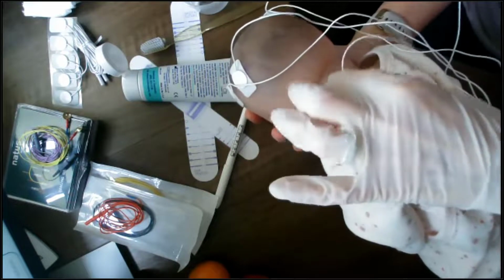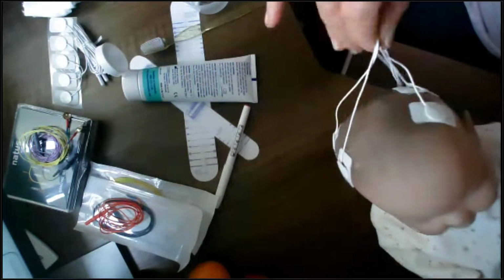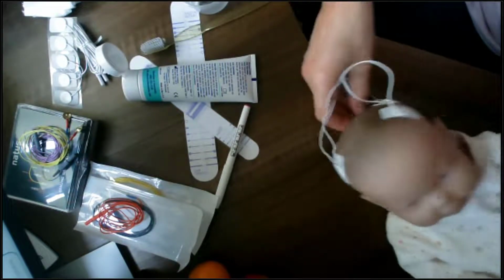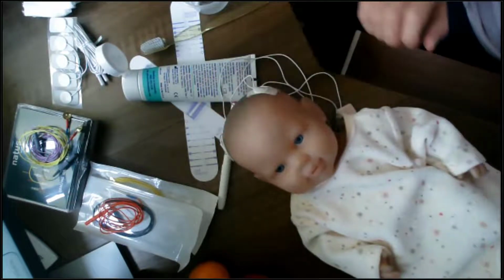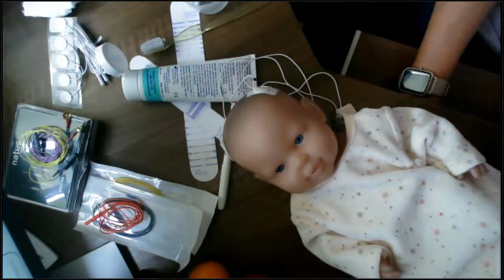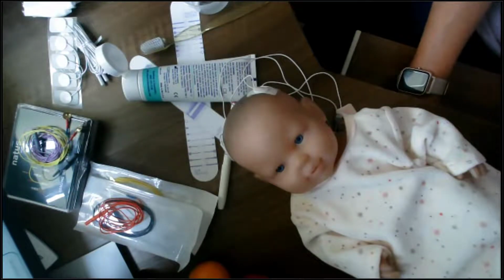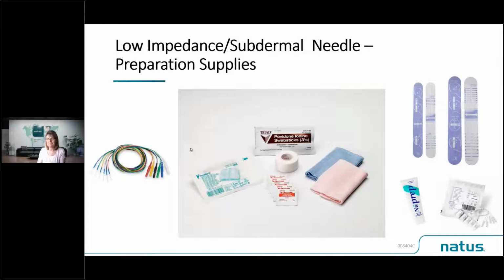But you'll notice that I've got my lead trailing upwards, and that I've got all of my head electrode leads trailing upwards. So this just makes electrode management much easier because all of my electrodes are facing in one specific position. So I hope that's helped to briefly go through the hydrogel electrode situation, and we'll move forwards to needle electrodes. So the supplies are slightly different with our needle electrodes.